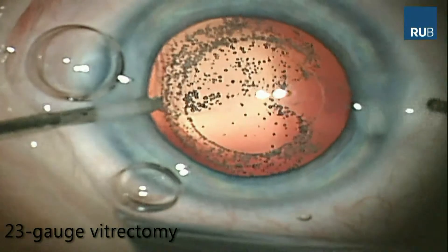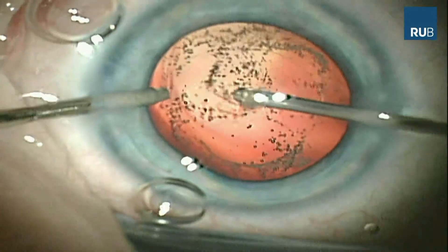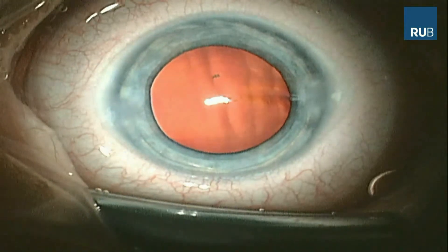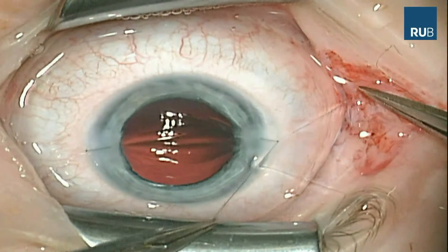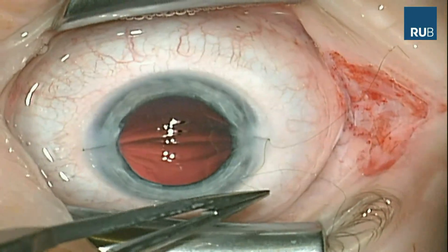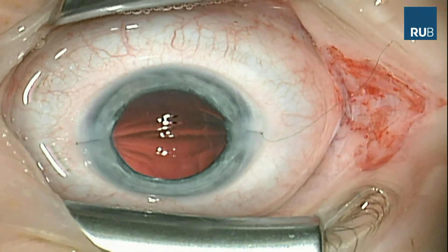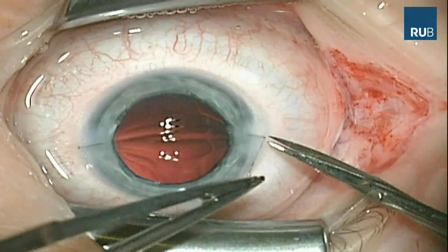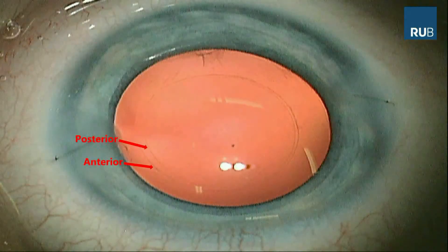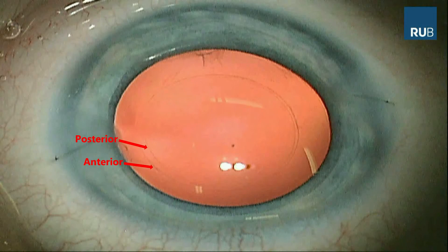A minimal 23 gauge anterior vitrectomy is performed and is made easier by the small gas bubbles from the femtosecond laser cavitation within the anterior vitreous. The paracenteses are sutured using nylon 11.0 and the lateral lid opening is also closed by a buried resorbing suture. We decided not to implant an IOL because of the very young age of the patient. The final retroillumination stereo coaxial view shows a near perfect, well aligned and centered anterior as well as posterior capsulotomy. The diameter of the anterior capsulotomy is 4.6 mm and 4.5 mm for the posterior capsulotomy, which can be regarded as optimal for secondary lens implantation like bag-in-the-lens or other lens modalities.